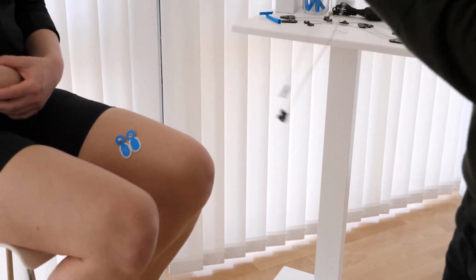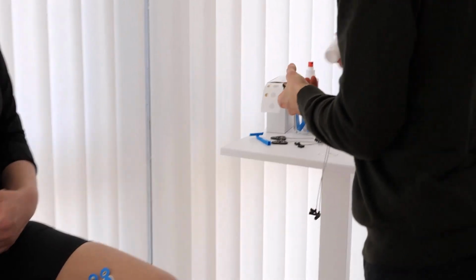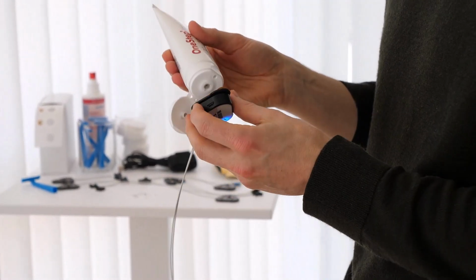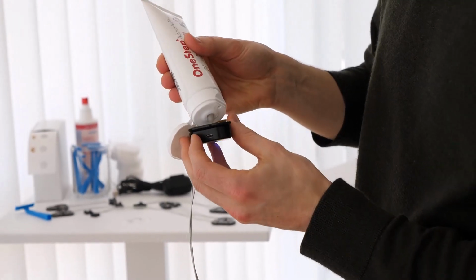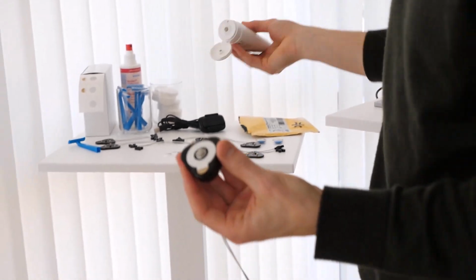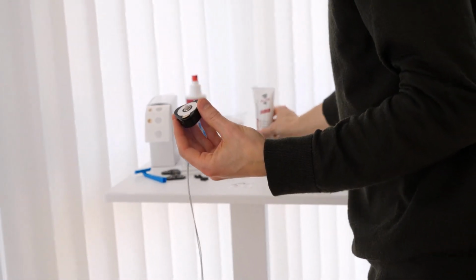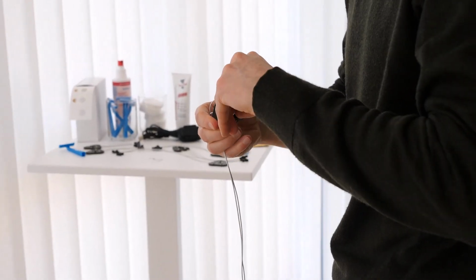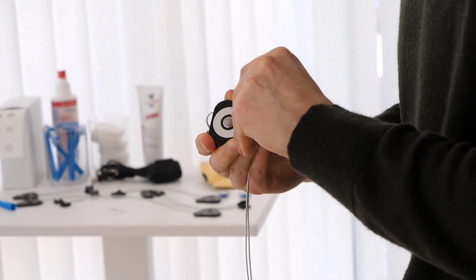Before we apply the sensor, contact gel, in this case an abrasive paste, must be applied. Not too much, so as not to cover the adhesive surface. Then the adhesive strip is peeled off and the whole thing is stuck to the skin.